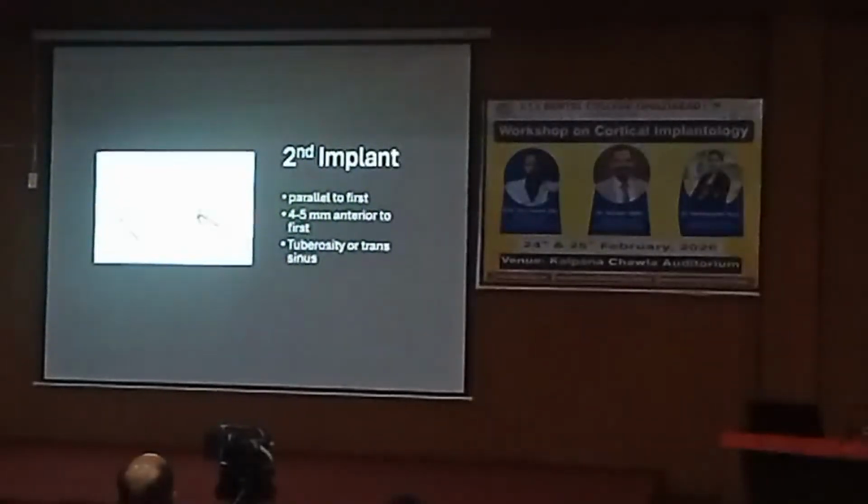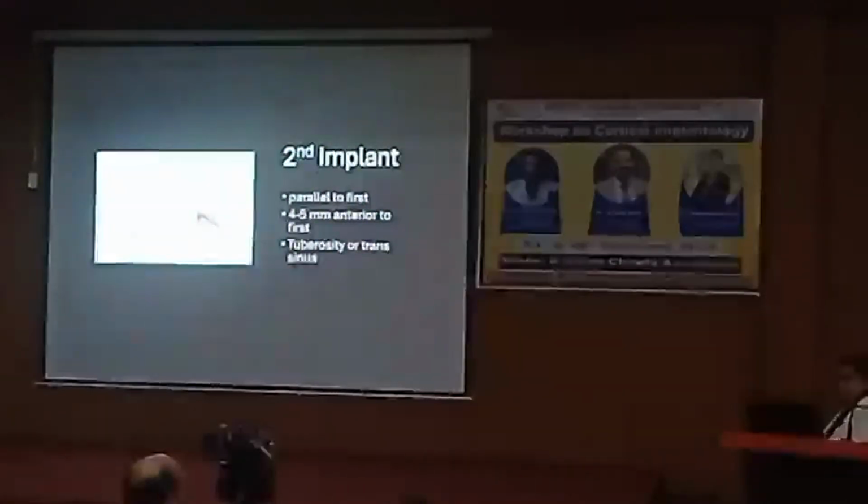If you have achieved primary stability, which is the initial torque, it means you are good to go. But you should engage it bicortically, because I also mentioned a point about pseudo torque: in the tuberosity, the torque also feels very high. So tapping your implant is very important.